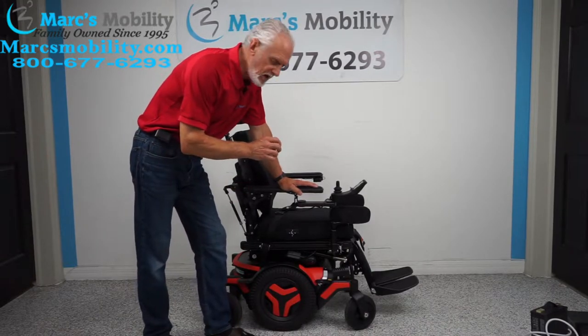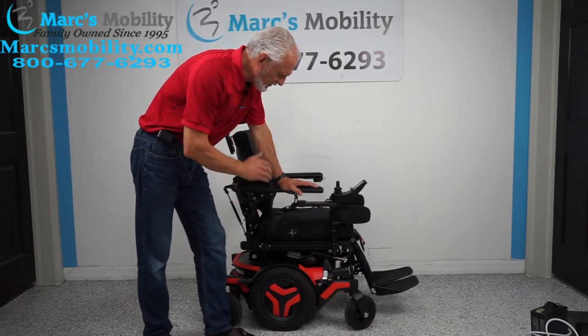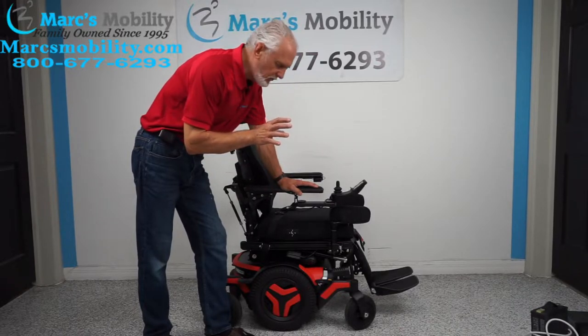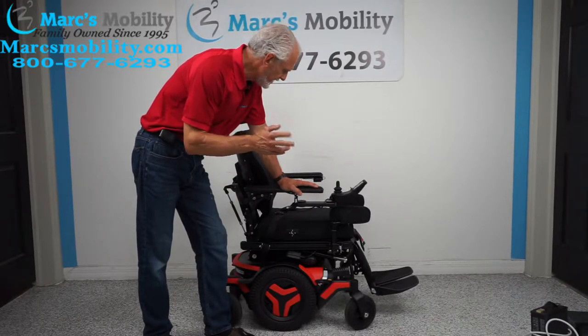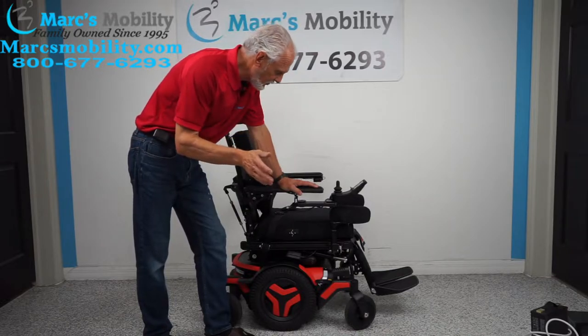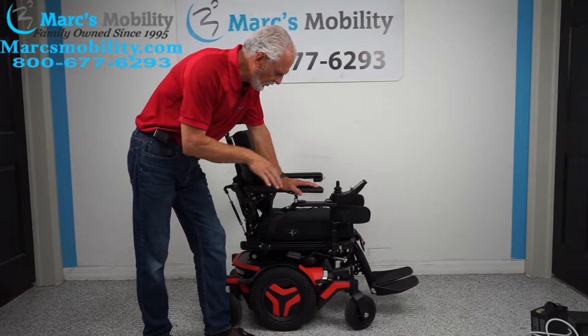This is a Permobil M3, mid-wheel drive. This power chair has 15 miles on it, so it was used probably for a couple of weeks — 15 miles total mileage, so it's literally brand new. This chair is fully loaded.